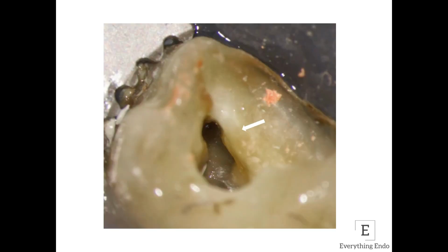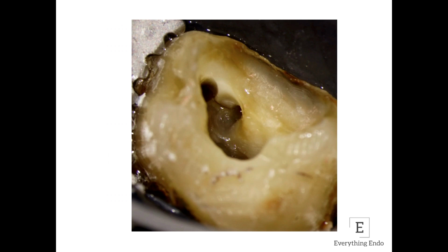Take this clinical scenario for example, where the MB canal has been located and shaped, but there is a shelf of dentine present. When you remove the shelf, you will find that the MB2 canal is present exactly under this shelf.